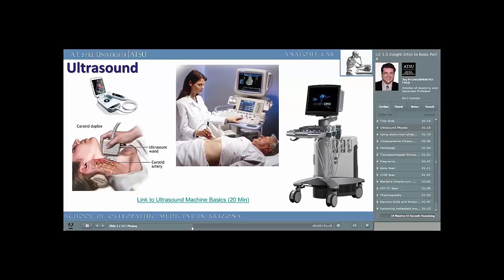Ultrasonography, because of its safety, ease of use, relative inexpensiveness, and of course portability, is used to image almost every part of the body. Here in the upper left corner, we see a handheld portable ultrasound unit manufactured by General Electric. Ultrasound, along with Doppler imaging, which measures blood flow in the blood vessels, can be used to assess for disease in blood vessels such as narrowing, also known as stenosis, plaque formation, atherosclerosis, or even fistulas, an abnormal communication between an artery and a vein.